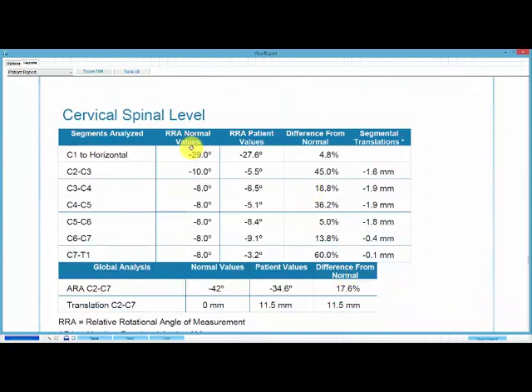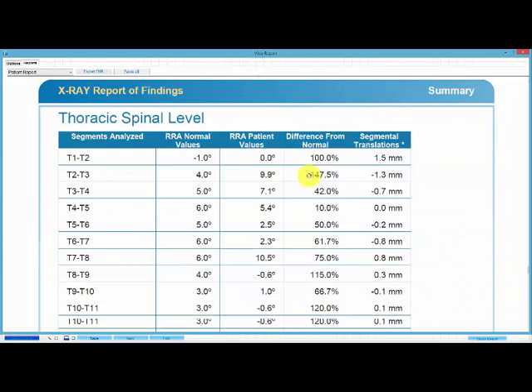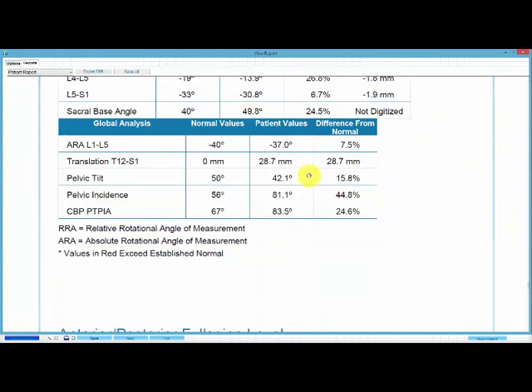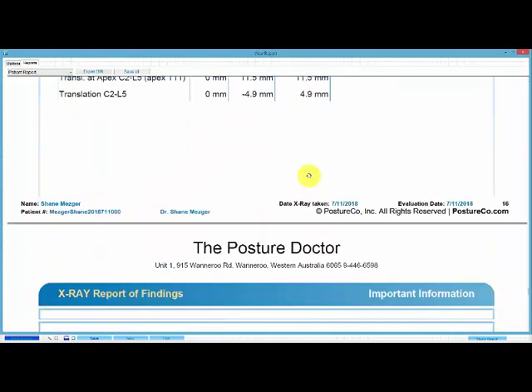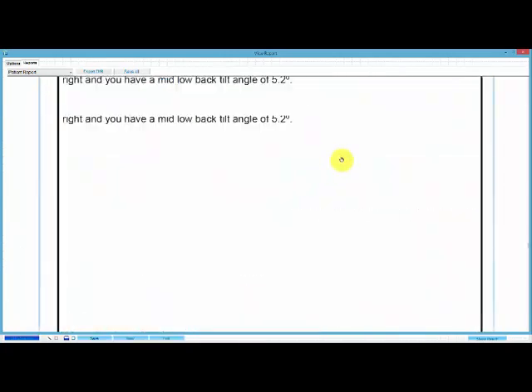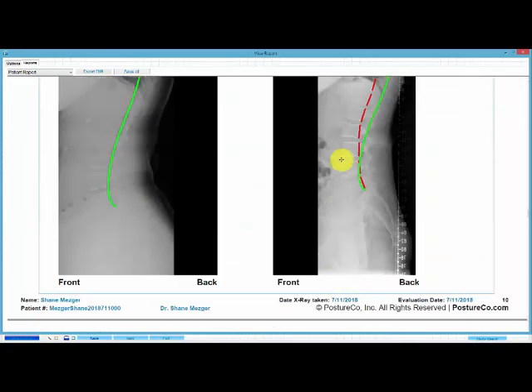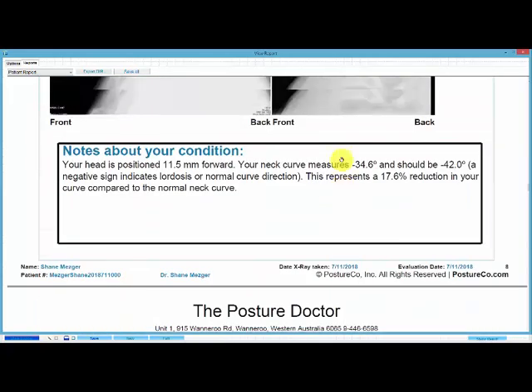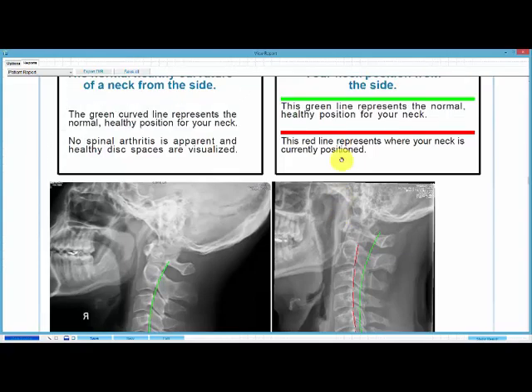We go through a whole set of angles showing normal values, patient values, and the difference from normal. The side view of my neck in extension shows possible ligament damage — there's a lot of information here. The good thing is that when we do follow-up x-rays to assess how the corrective care program is going, we do a comparison that tells us exactly how much improvement has been made. That's a summary of how we do x-ray analysis at the Posture Doctor — it's a very important part of our analysis, giving us something objective to work towards.